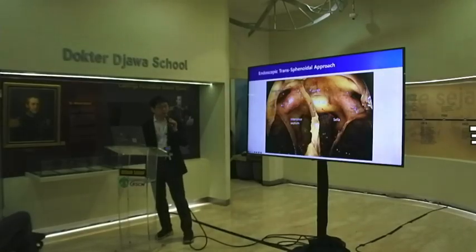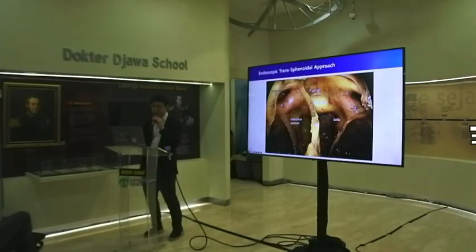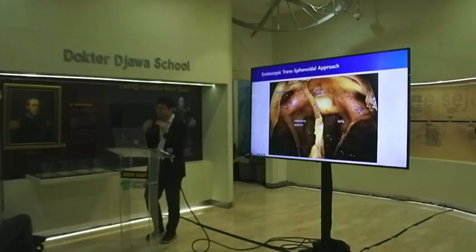Your job is to drill all the septums to make the surgical field very clean. In skull base surgery, you will get used to seeing the optic tuberculum, the medial opticocarotid recess and lateral opticocarotid recess, and afterwards you should remove all these intersinus septa to expose the sellar area.